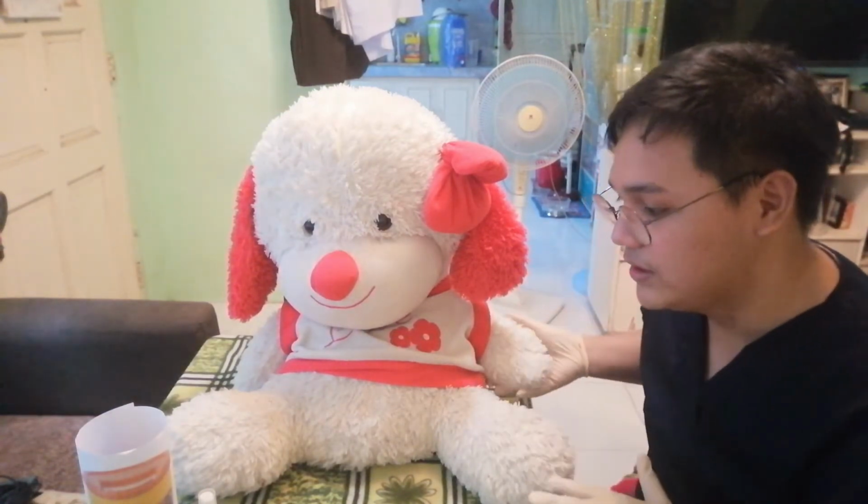And after that, we will need to check also if there is presence of any heavily pigmented areas on the client's skin, as well as if it is covered with hair. And if there is presence of what I said, we will need to find another site to inject our medication. Okay. And for this instance, as you can see here, because our patient is a teddy bear, it is a fact that a teddy bear is hairy. So, supposedly, we will need to assume that it is a real person.